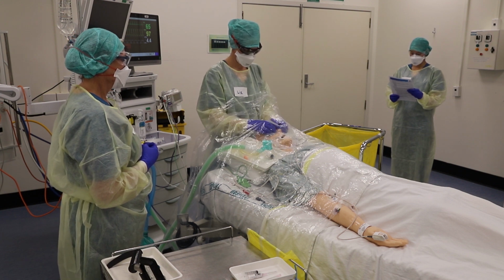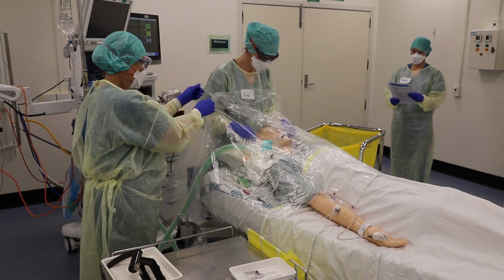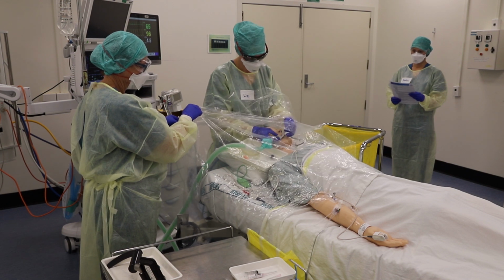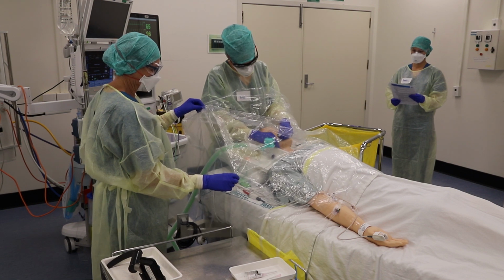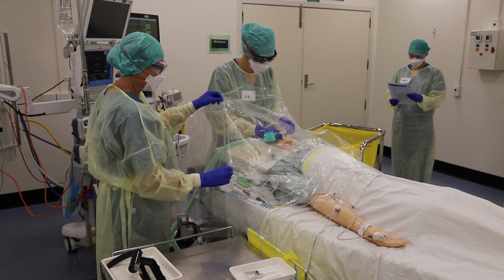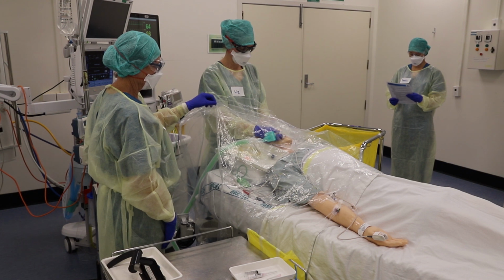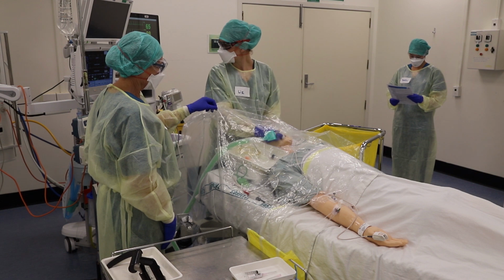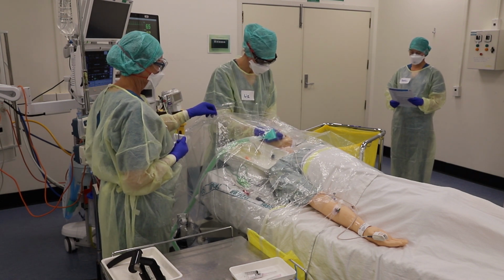Anaesthetist removes eye tape and tape from tube. So the eye tapes are off. And the tube tape is released. Tech switches machine to manual ventilation and opens APL. Okay, so we'll just wait a few minutes for the volatile to come off and be ready to take that tube out.